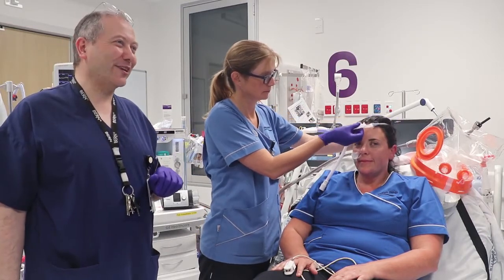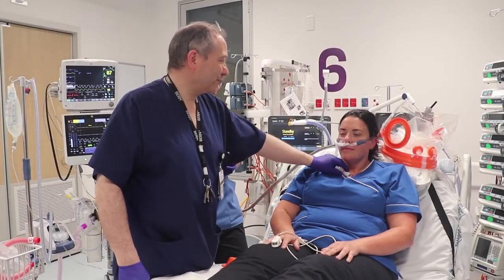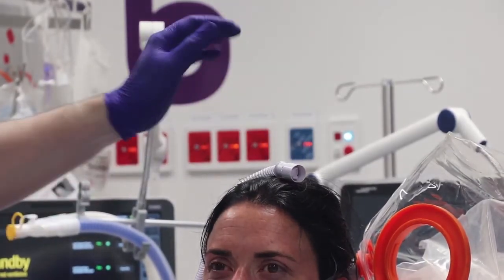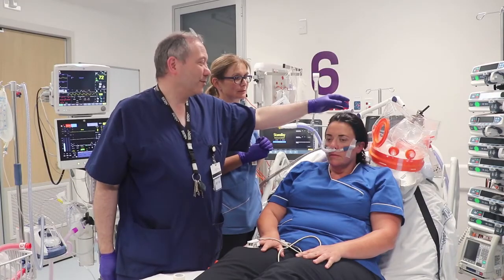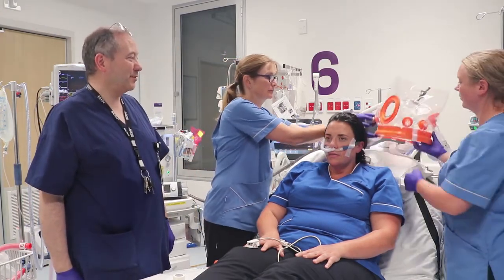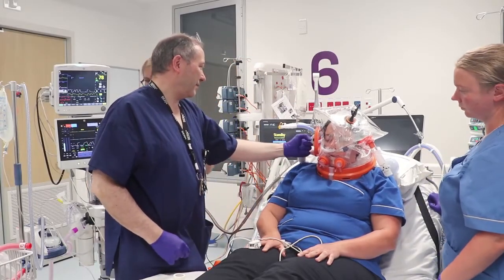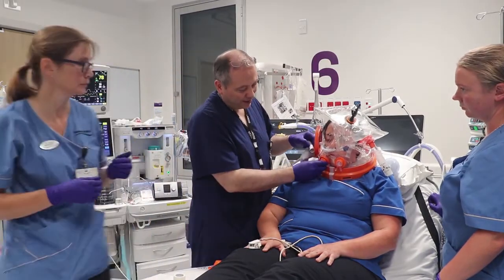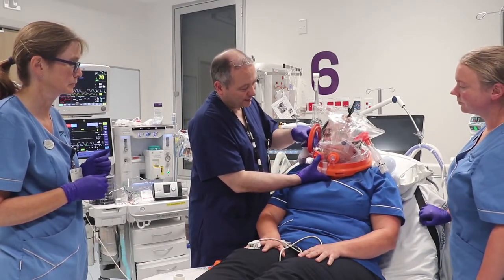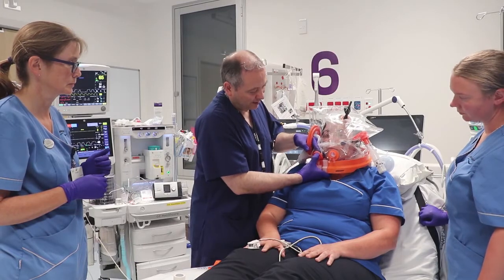We place the end of the ERVO2 nasal cannula on top of Carla's head. Next we put the helmet on — Sarah and Louise carefully place it over Carla's head. We take the tube from the side of Carla's head and apply it to the designated port on the helmet. This port is specifically designed so the ERVO2 fitting clicks perfectly into place.